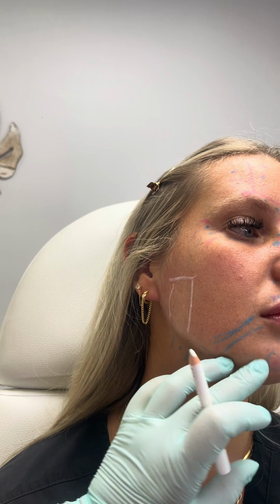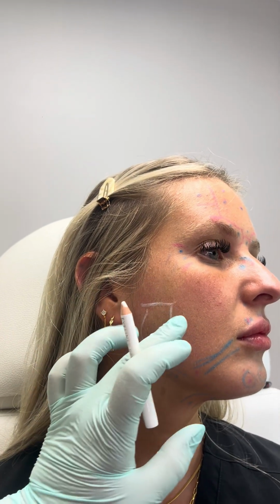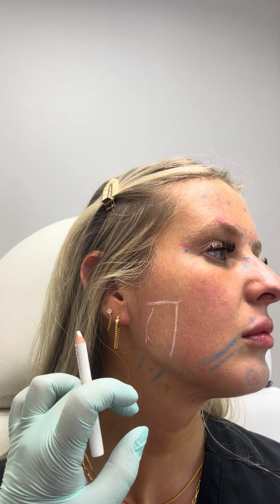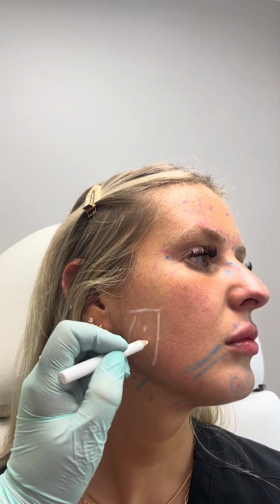Good. So her masseter is a little bit larger than this, but I like to draw a smaller border just because this is going to be the safe zone. If you go a little too superiorly, a little bit too laterally, or even if you go too posteriorly, you could be hitting structures that you're not intended on hitting. So what I like to do, and again, it's patient dependent, but for her masseter and the shape, I'm going to do a little triangle just like that.